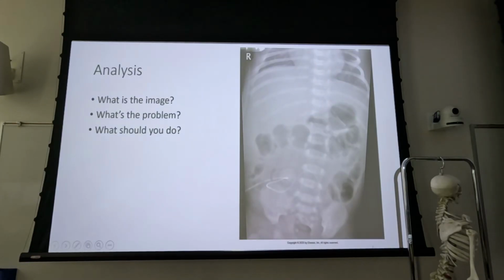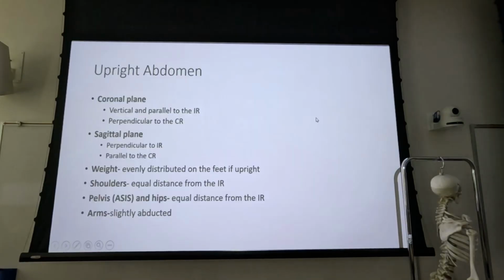So I'd be very sensitive to radiation exposure on kids because they're sensitive to radiation exposure. But we've also got rotation on this patient. So everything's a matter with that. But again, I would check with somebody before repeating.